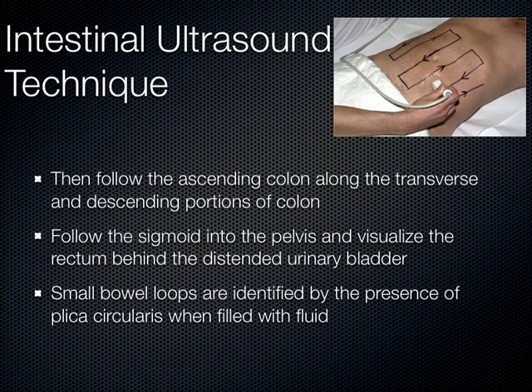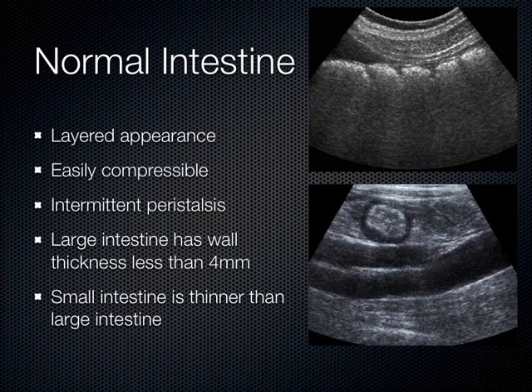And then, again, to try to differentiate small bowel from large bowel, it's difficult to do with air-filled loops of bowel in normal individuals. But when the patients have disease states, then you can really make out the plicae circularis. I'll show you some examples of that.